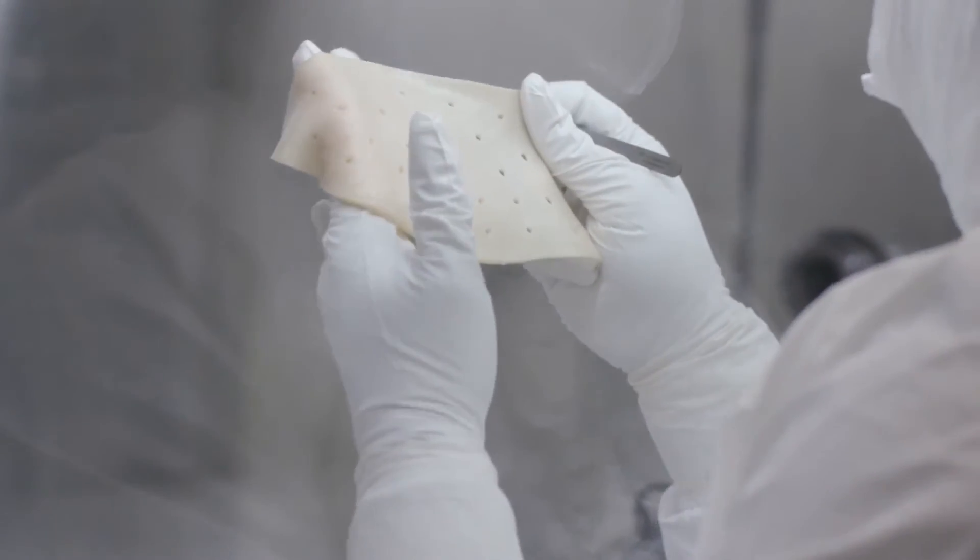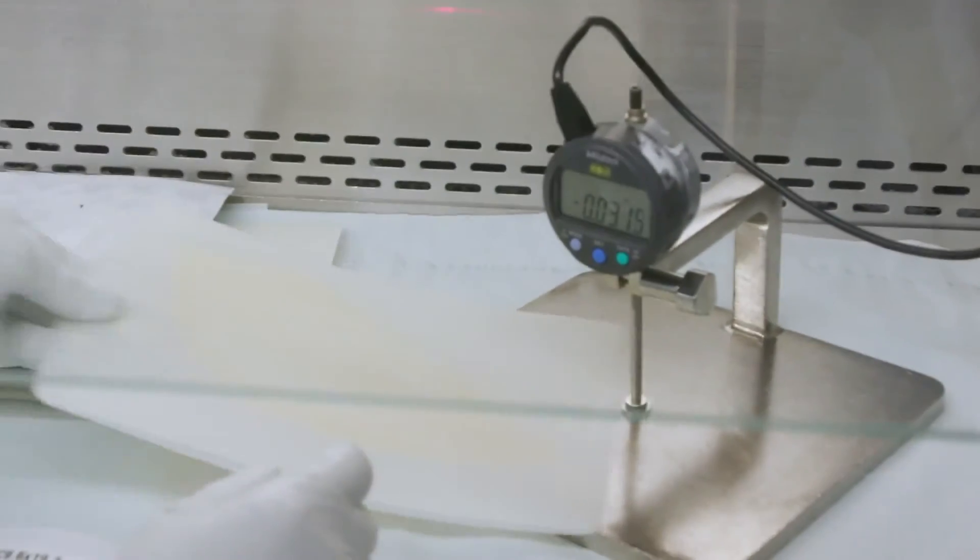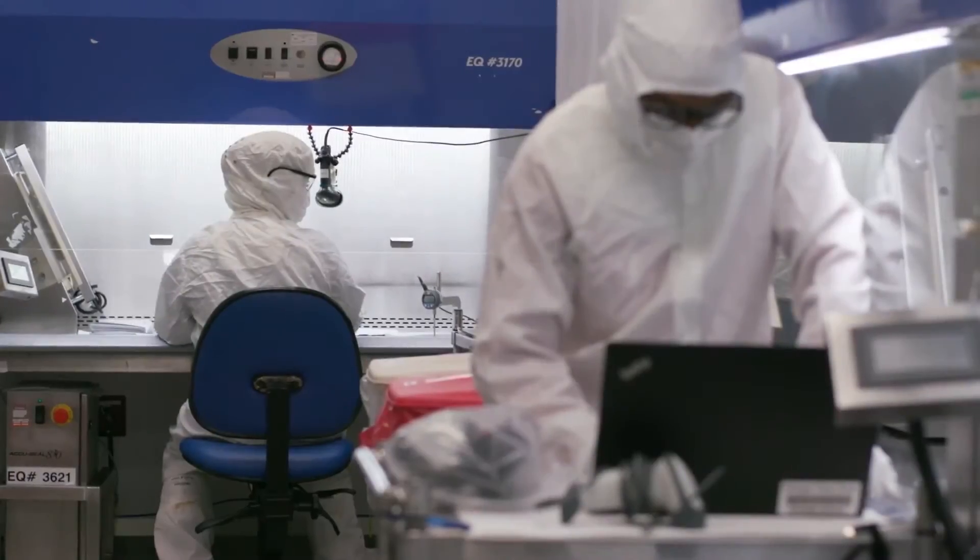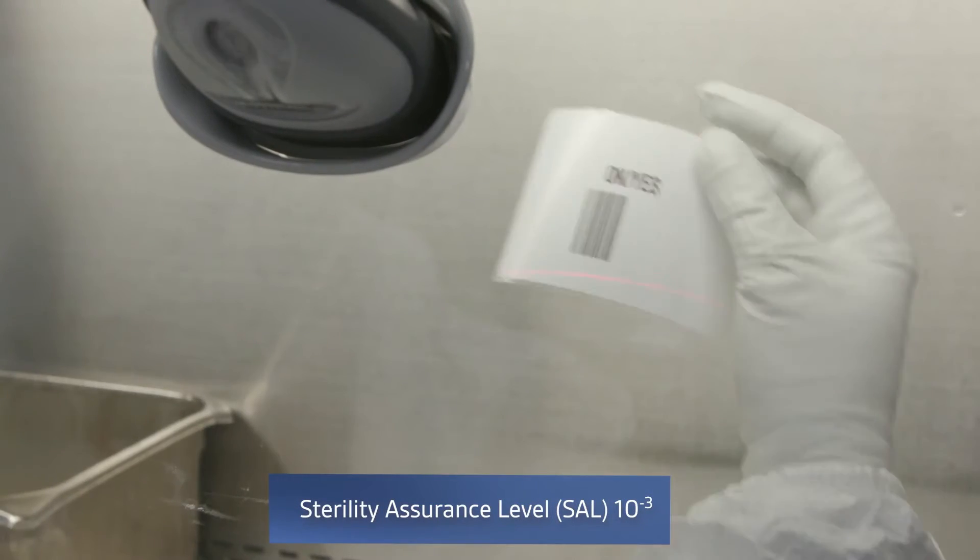Once it passes visual inspection, the piece is carefully packed by hand into its internal pouch and measured to ensure proper uniform thickness. Labeling is then applied and the packaging is sent to be sterilized.